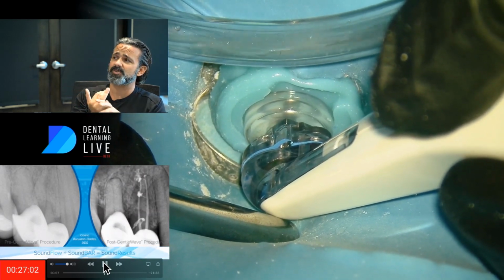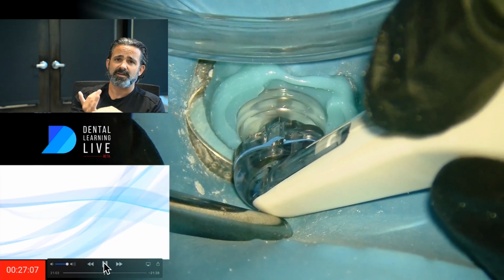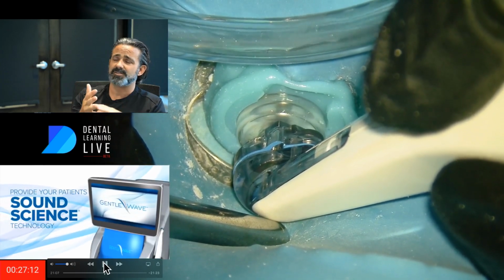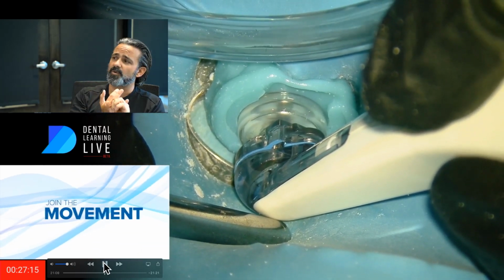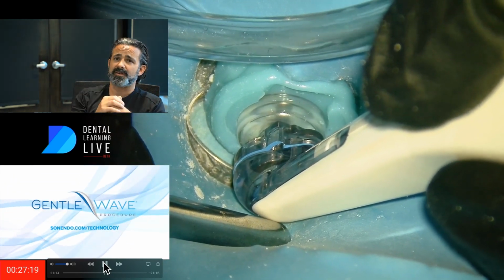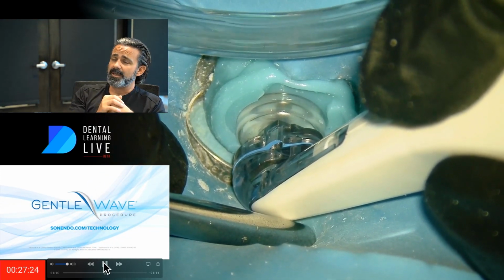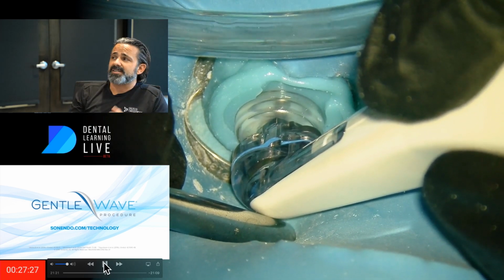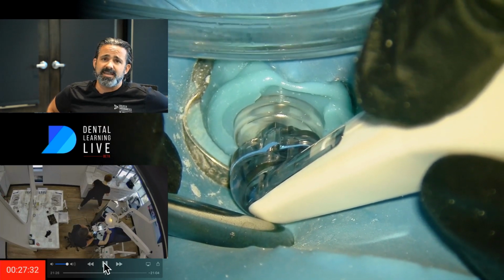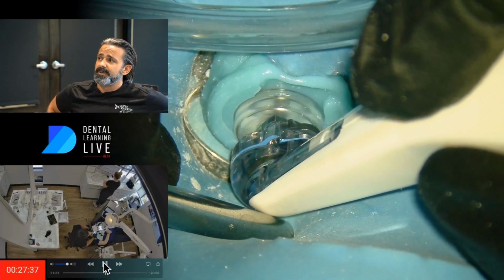I mean, we still have chemistry going on. So the fluid dynamics in this chemical environment accelerates the chemistry, just like any sort of agitation would. It's a catalyst, you should say. But then I also have physical force happening with the sound wave. So we have a lot of different things happening with this technology concurrently, all at the same time. And because of how it gets exhausted through the procedural instrument, the net effect is this negative environment. And we use that negative environment to try to keep things safe.